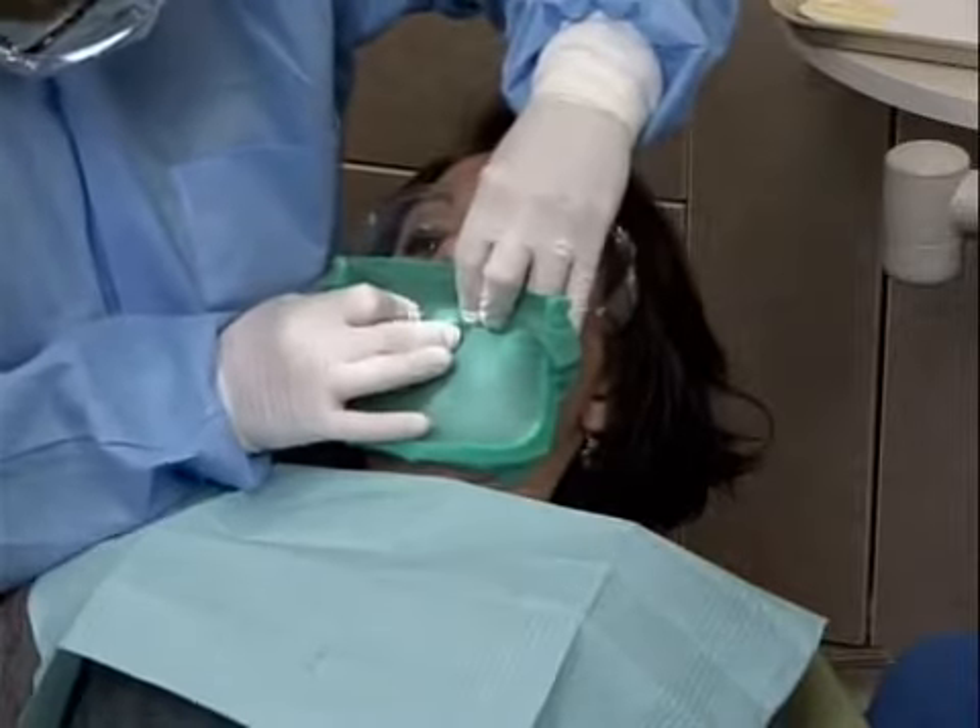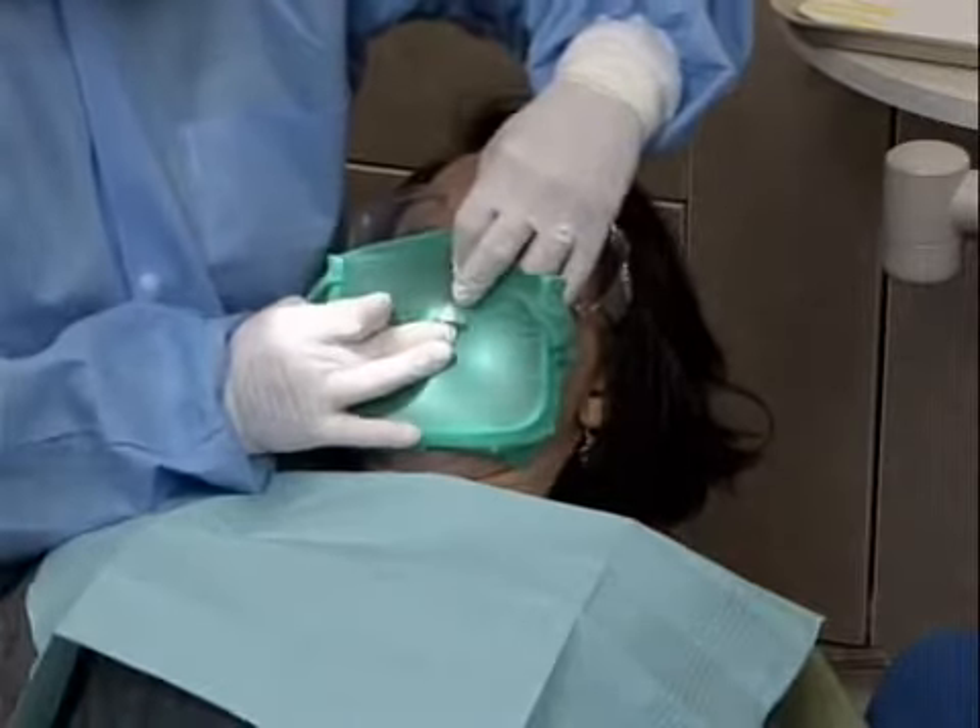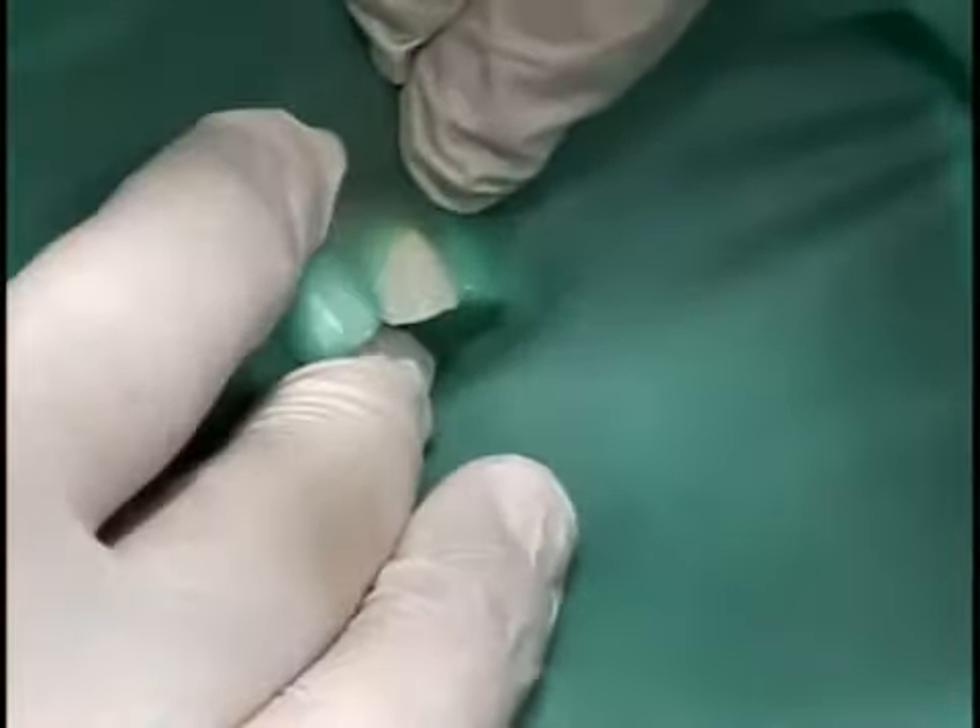Carry the dam and frame to the mouth as one unit and slip the dam over the anchor tooth. Wrap the Wedgetts Cord around the tooth.